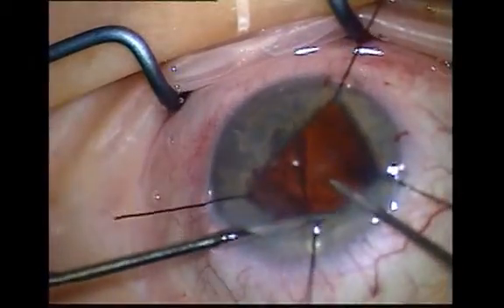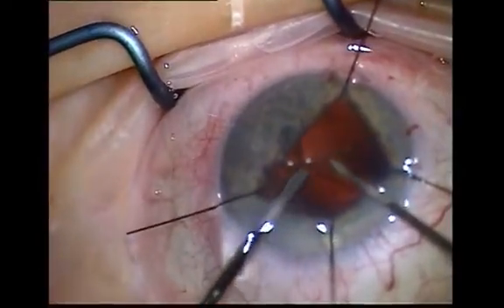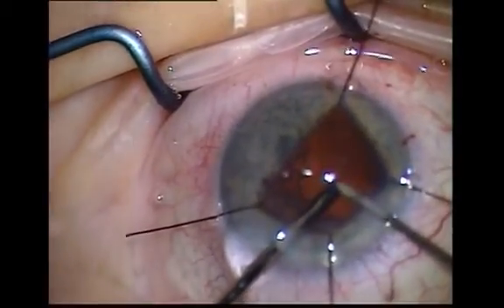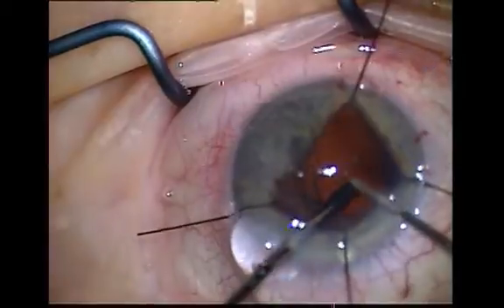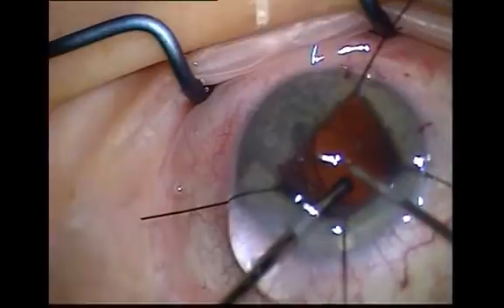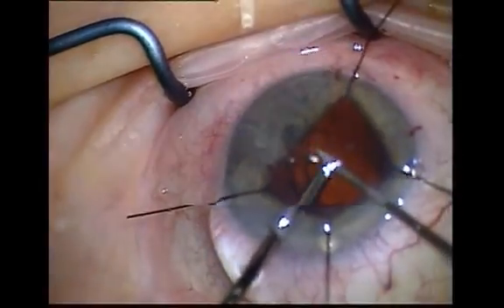Always use a separate infusion — for example, a 19 gauge butterfly through a separate infusion site. Enlarge the paracentesis to allow the vitreous cutter through this port. Direct the flow of BSS away from the capsular hole rather than into it.